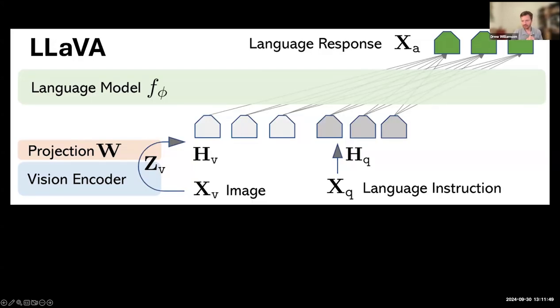All right. So I think some of the novelty here for this paper was not so much building a new architecture for something like this, but assembling different ingredients. So I kind of think of this as like a recipe for something that we built. And so we use this LLaVA model, which is from Microsoft Research, that couples a large language model here in the top left with a vision encoder, a projector, and I guess that's it. I made it sound like there was going to be another thing, but really that's what you've got.